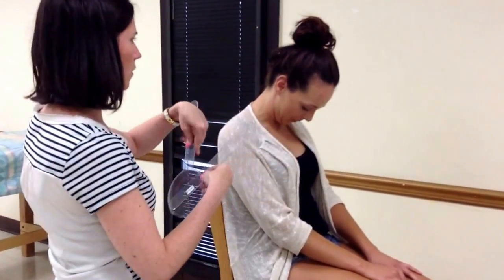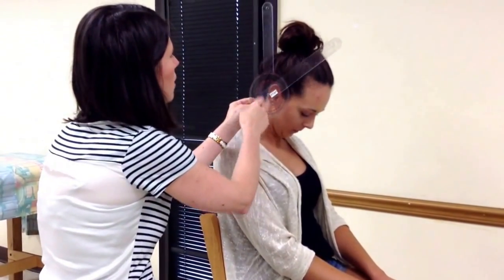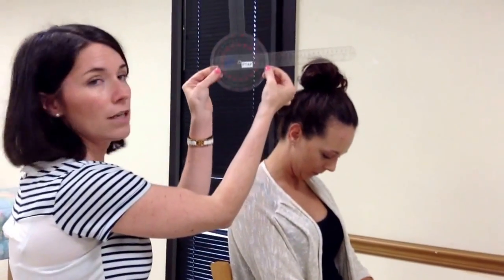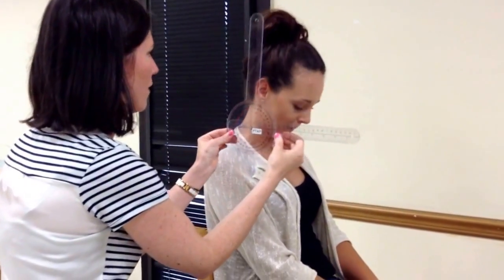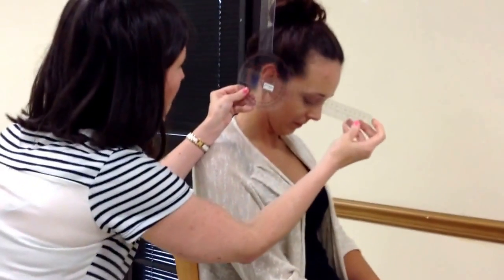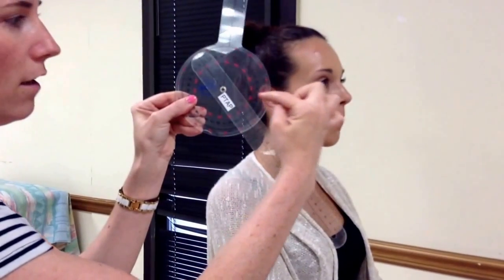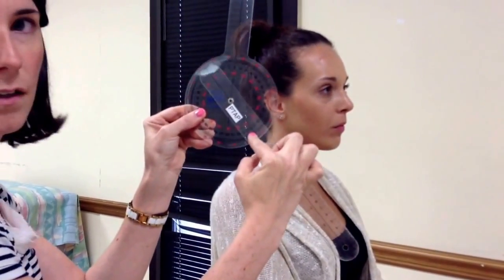The fulcrum of the goniometer goes right over the external auditory meatus. The stationary arm is going to be perpendicular to the ground. The moving arm starts at 90 — that's where I'm going to read from. The moving arm comes down and it aligns with the base of the nares. Then I read from where I started here at 90 degrees down to here, and that's my measurement.